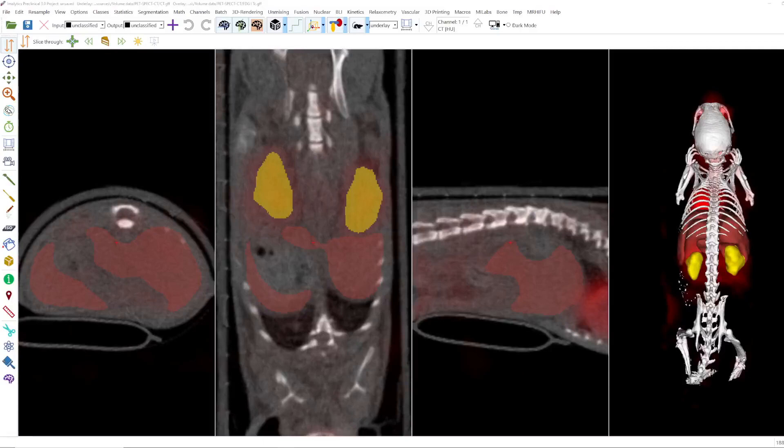Welcome! In this short video I would like to explain the mouse action 'slice through'. You can find it here, symbolized by these two orange arrows on the top of the mouse mode toolbar.